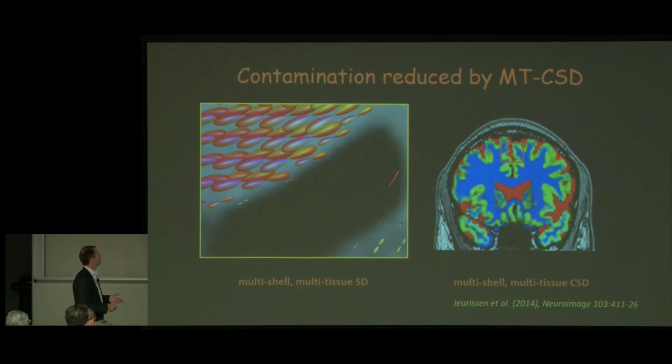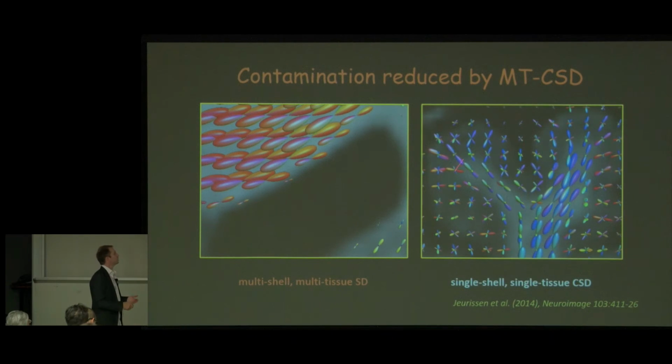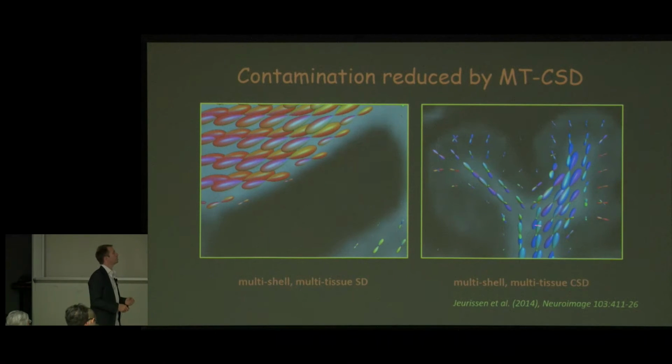So we've completely cleaned up the ventricles, and in the grey matter part, same thing. Note that we still get these radial projections here in the cortex, but by and large the grey matter signal has been moved over to its grey matter component, and the white matter component remains. So it's nice to see these kinds of structures because we know there's going to be axons projecting quite deep into grey matter, but not necessarily uniformly and not necessarily with a very strong density.